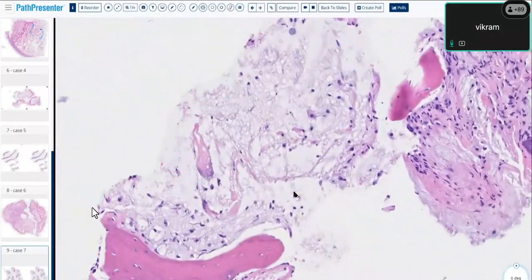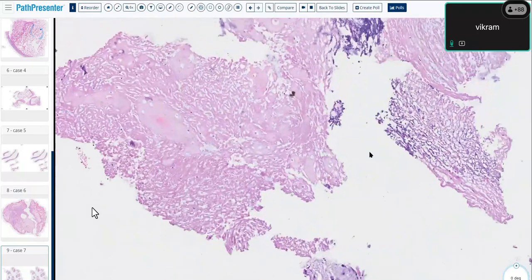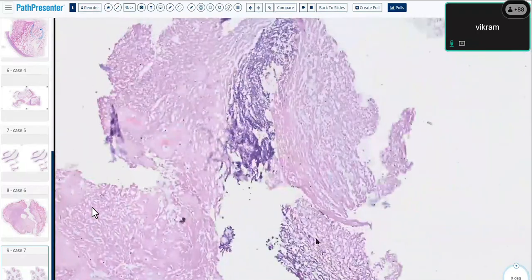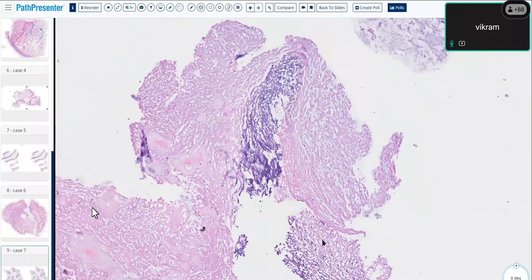This is one situation when you see malignant bone, you do not call this an osteosarcoma. So this is a dedifferentiated chondrosarcoma. This is one of the most malignant neoplasms in bone pathology. You almost never see them survive. They almost never survive beyond 2 years unless they're very, very small. They are resistant to chemotherapy. And whether there is osteosarcomatous differentiation or not really doesn't matter. Once you have a dedifferentiated component, that's pretty much the end of the story.